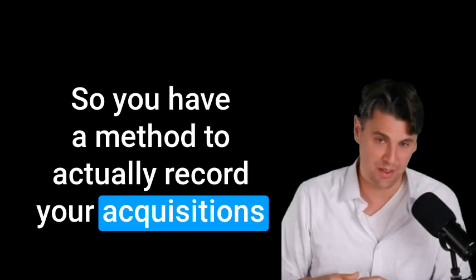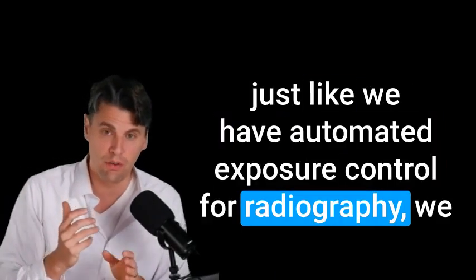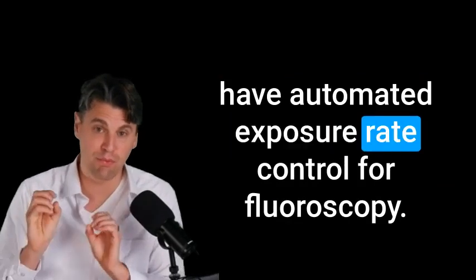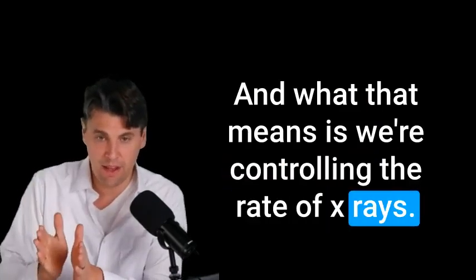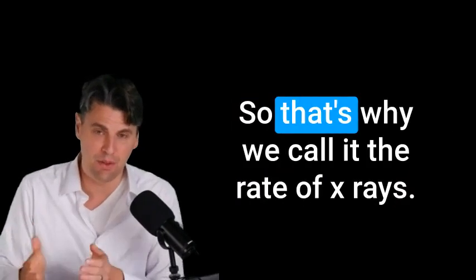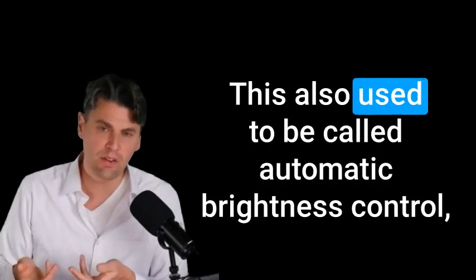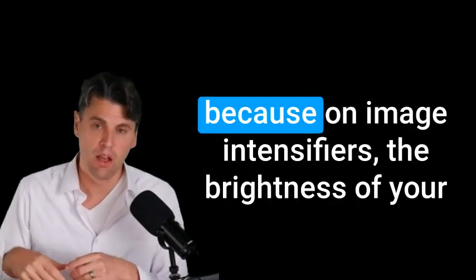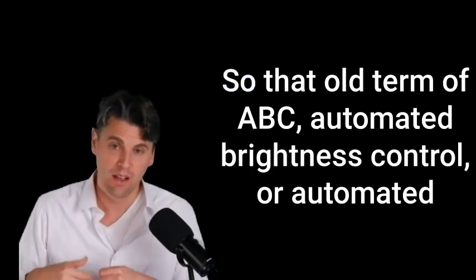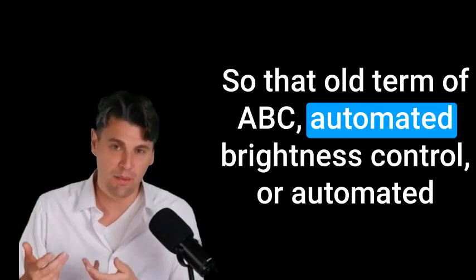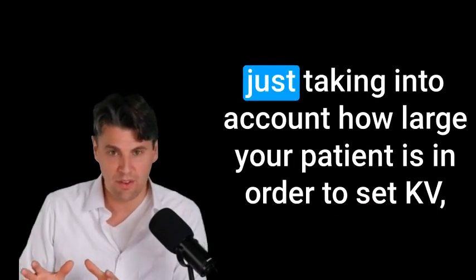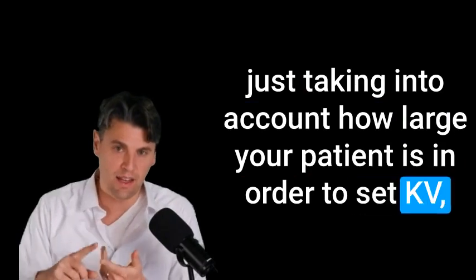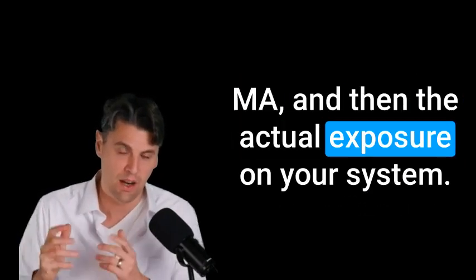Just like we have automated exposure control for radiography, we have automated exposure rate control for fluoroscopy. And what that means is we're controlling the rate of x-rays. So we're controlling the dose per unit time. So that's why we call it the rate of x-rays. This also used to be called automatic brightness control because on image intensifiers, the brightness of your image actually depended on the radiation dose. So that old term of ABC, automated brightness control or automated exposure rate control, those are the same things. And it's just taking into account how large your patient is in order to set KV and then the actual exposure on your system.